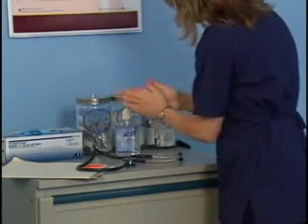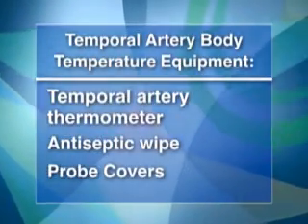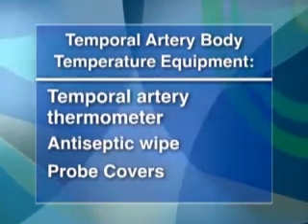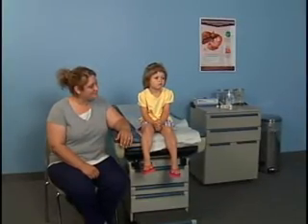Sanitize your hands before proceeding. Assemble your equipment. You will need a temporal artery thermometer, an antiseptic wipe, and probe covers, if your model uses them. Greet the child's mother and introduce yourself.